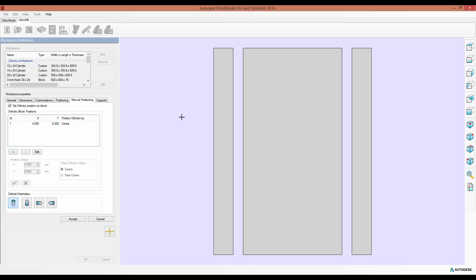So each time you use the workpiece, the part with a matching ID will be positioned in the X and Y coordinate. And the origin for this is always at the center of the workpiece. So no matter where you may have set the axis origin of the entire model, perhaps it's in the corner of your workpiece, the Manual Positioning in this tab will always be done around the workpiece center.